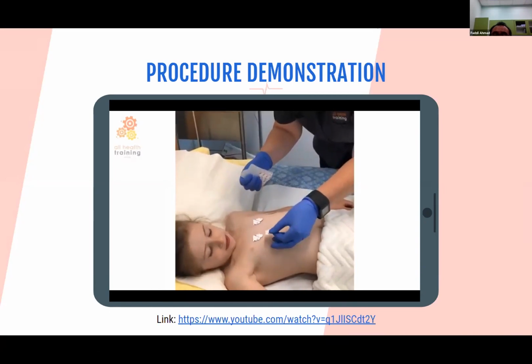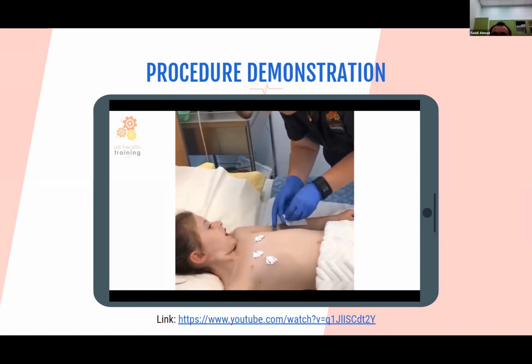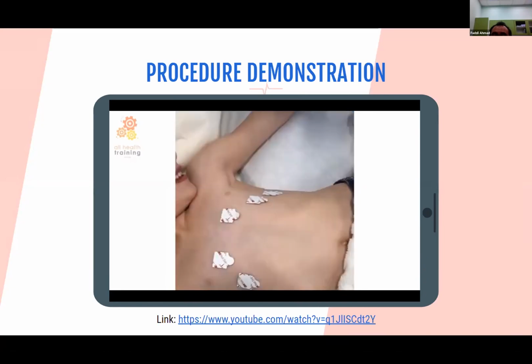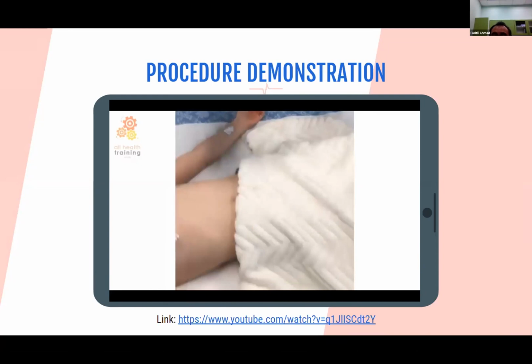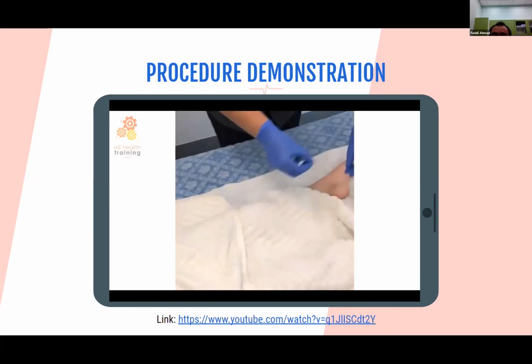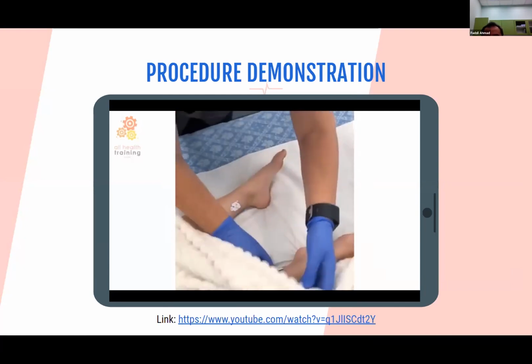So this one is coming where? About here? On the child, we place one of the electrodes over to the right side of the chest. And then one comes under your underarm. Just under here. How's that? One more. And electrodes on the wrist will then be placed facing down. And one on the other one. Good job, you're a good helper. And ankles facing up.